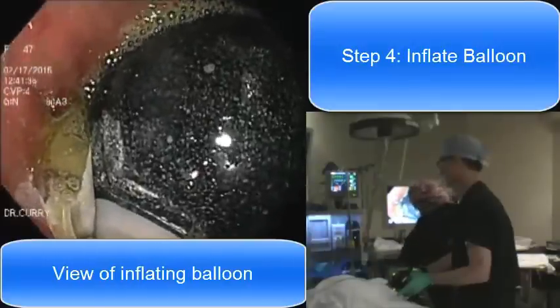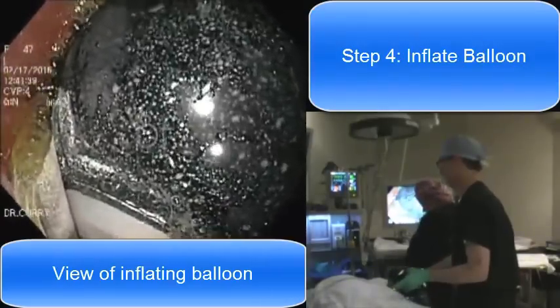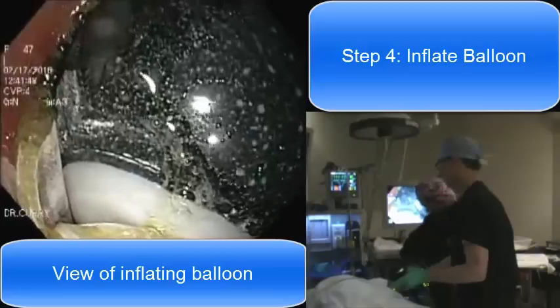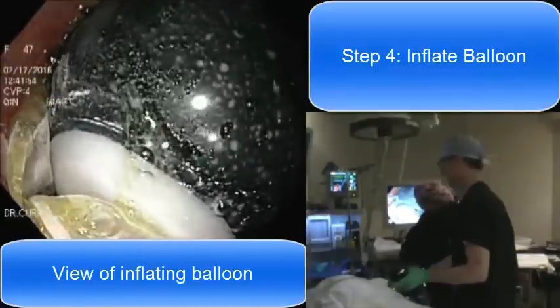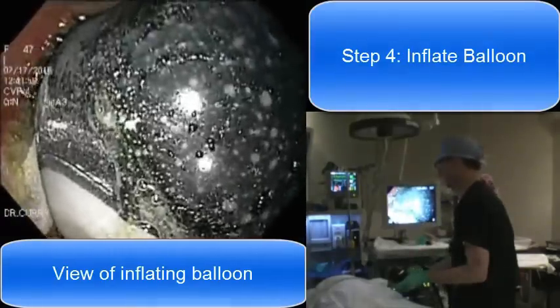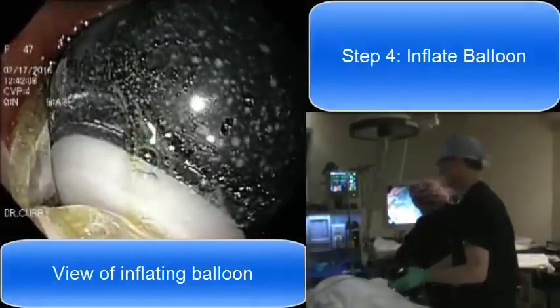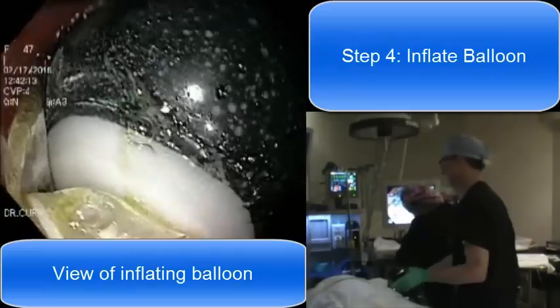After this procedure, the patient is going to get full earlier because this balloon is taking up a lot of space in the stomach — roughly a third to half of the stomach's volume, depending on the patient. So when you start to eat, theoretically you're already maybe half full, which significantly reduces portion sizes. But in order to be successful with the gastric balloon, it still relies on eating a healthy diet and exercise. When you combine the balloon, healthy diet, and exercise, patients will typically lose anywhere from 30 to 50 pounds, depending on their starting weight and body mass index.